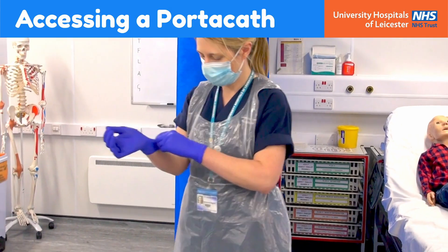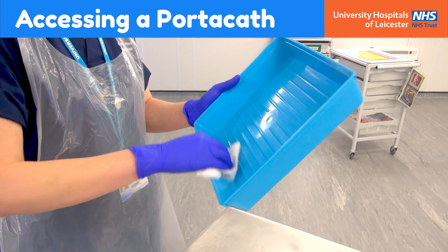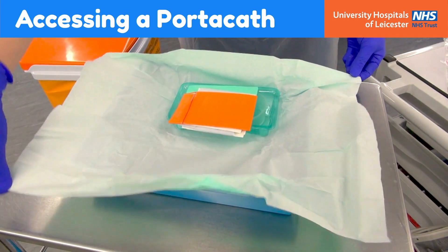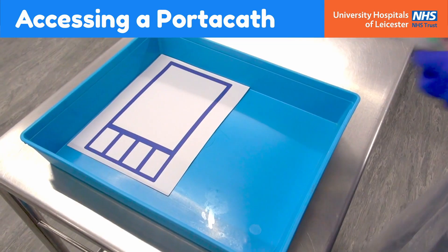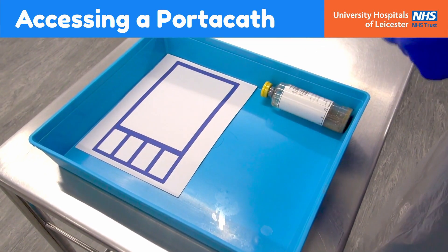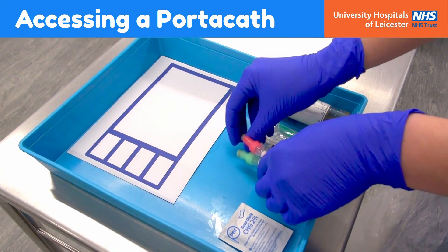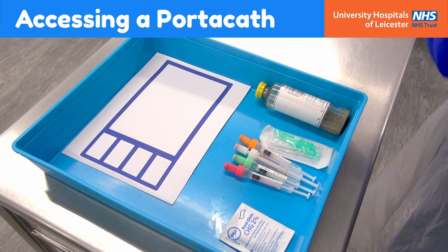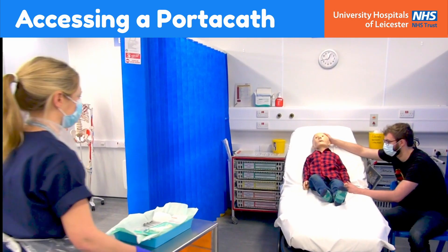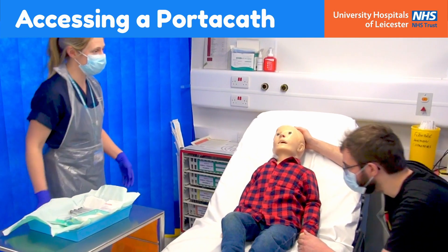Put on gloves and an apron and then clean a trolley and blue tray with Clinell wipes. Open the items into the tray in a sterile manner. If you are planning on taking blood samples, place the blood bottles in a separate tray with the request forms by the bedside. Keep another chlorhexidine wipe and a needle in this tray for preparing the blood culture.